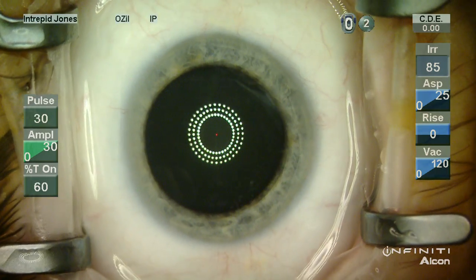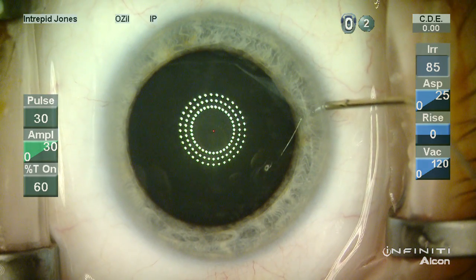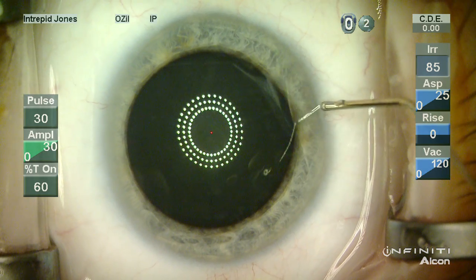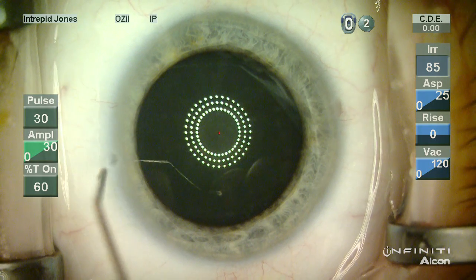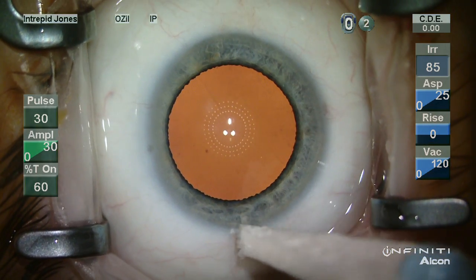In this case you can see that I have an intraoperative illuminating keratoscope. This is also from Mastel and it can be used as a helpful guide intraoperatively. Notice the oval orientation of the marks of the keratoscope.